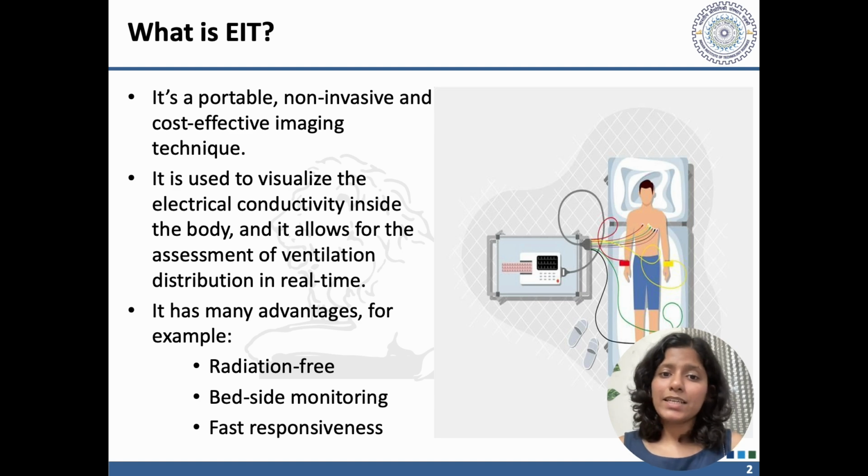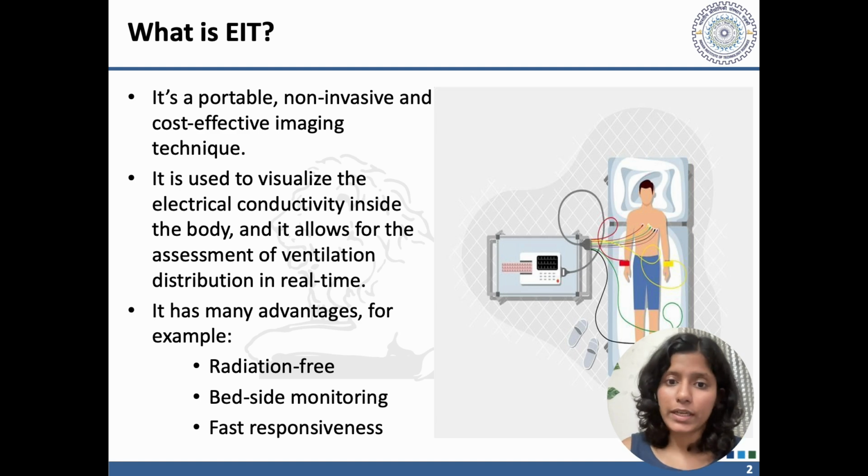So, what exactly is electrical impedance tomography? EIT is a portable, non-invasive and cost-effective imaging technique. It helps us to visualize the electrical conductivity distribution inside the body or the region of interest, offering a real-time assessment of ventilation distribution. One of the key advantages of EIT is that it's radiation-free, which makes it safer compared to traditional imaging techniques. It's also useful for bedside monitoring with fast responsiveness.